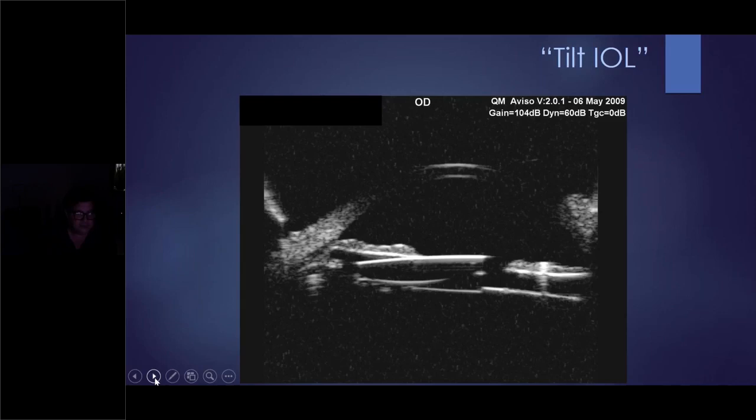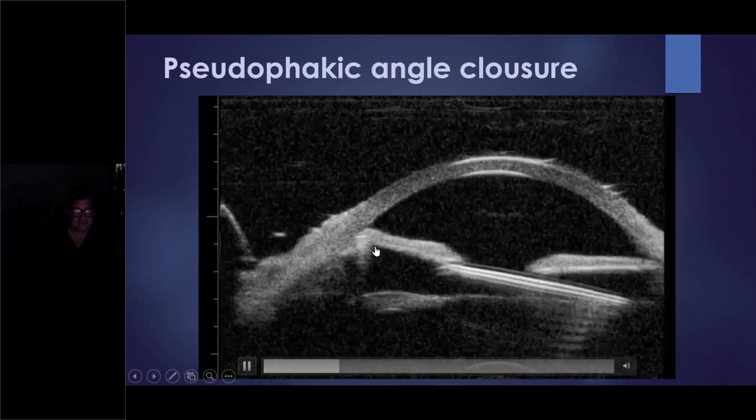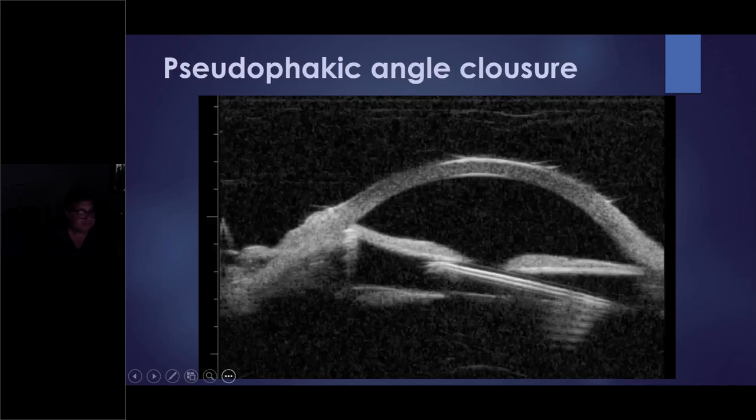Another displacement, one is in the back and the other is in the sulcus. You can see the tilt and the prismatic effect that you get with the lens. Look, this is an angle closure due to the optic being in a bad position, and you rotate it because you have enough capsule to make a rotation of the lens. This is very important to do if you are a surgeon.